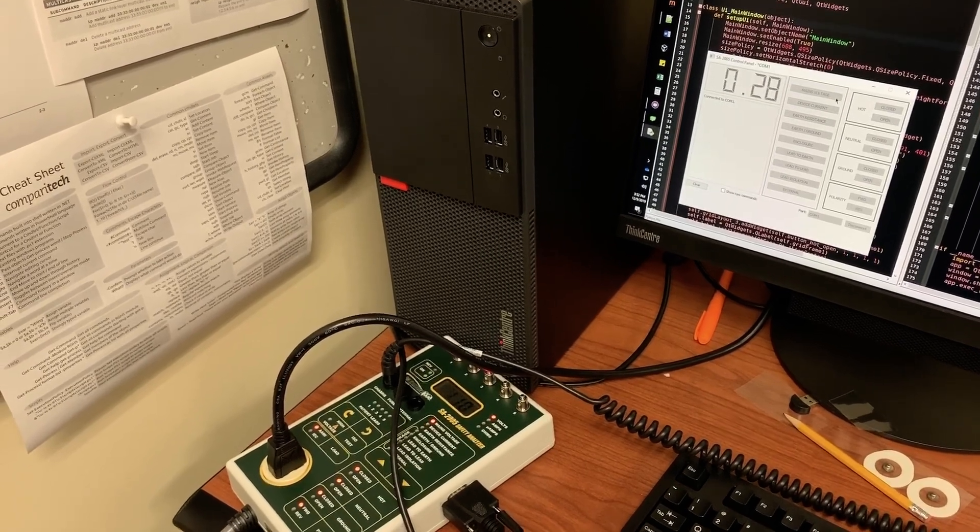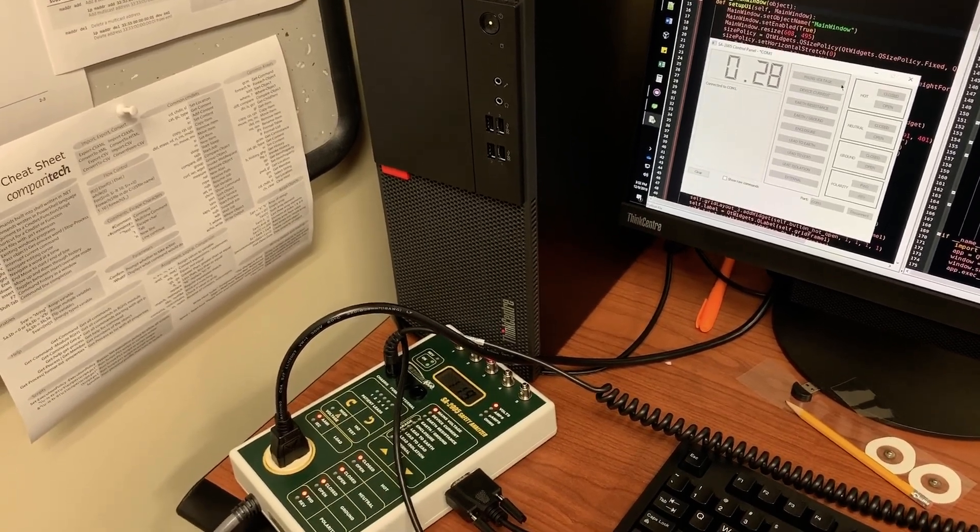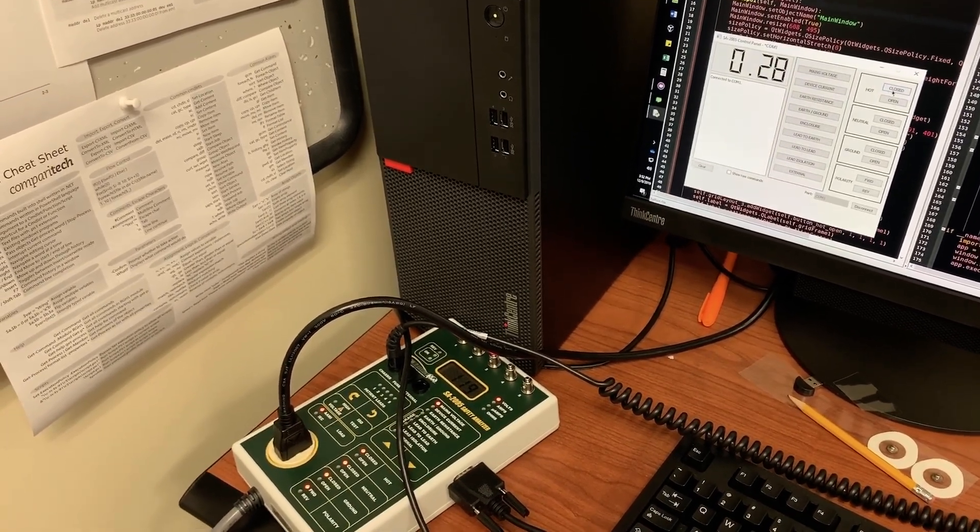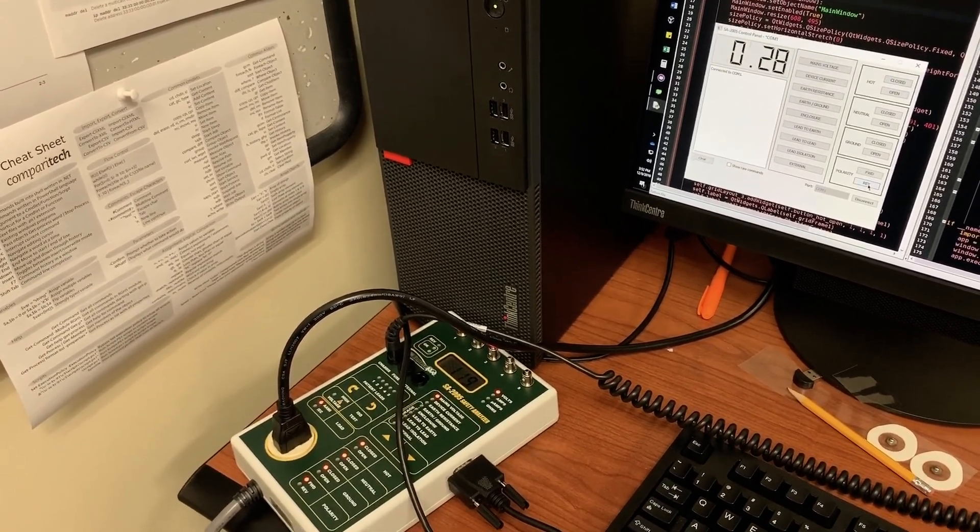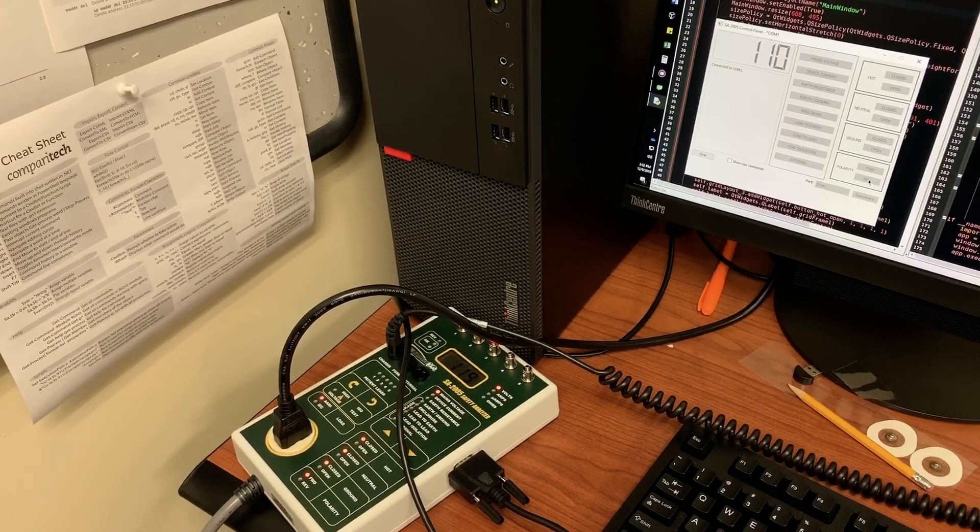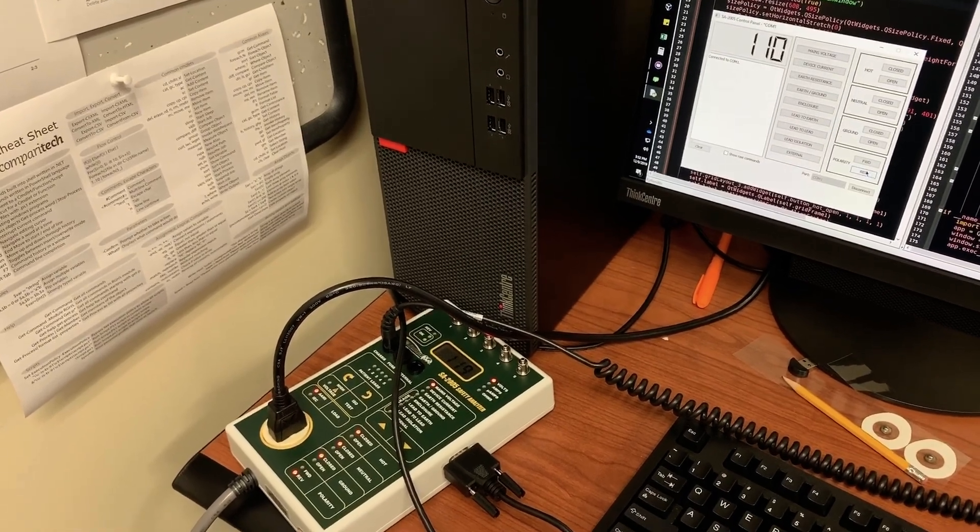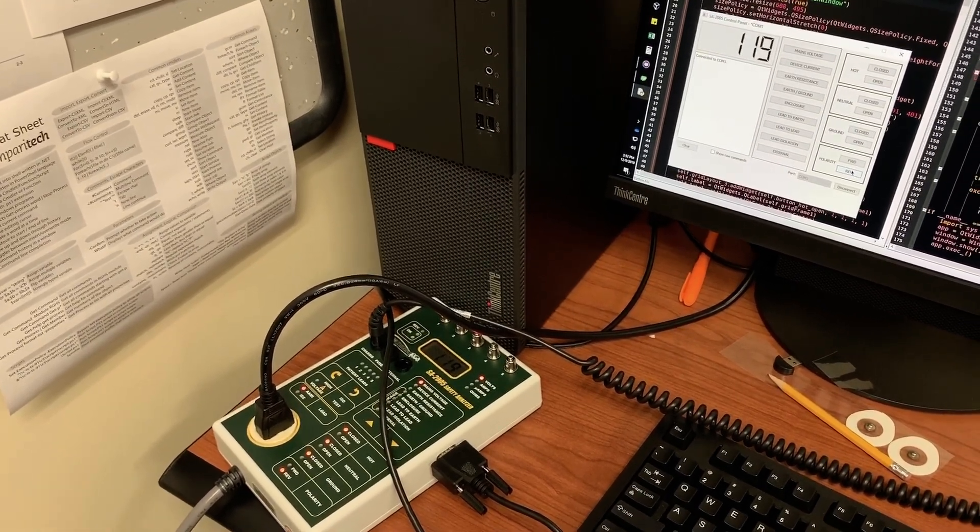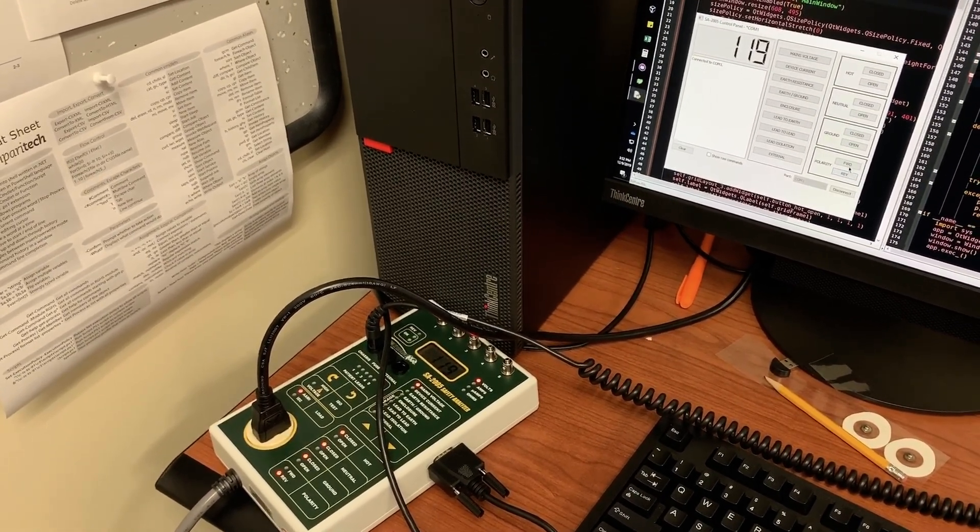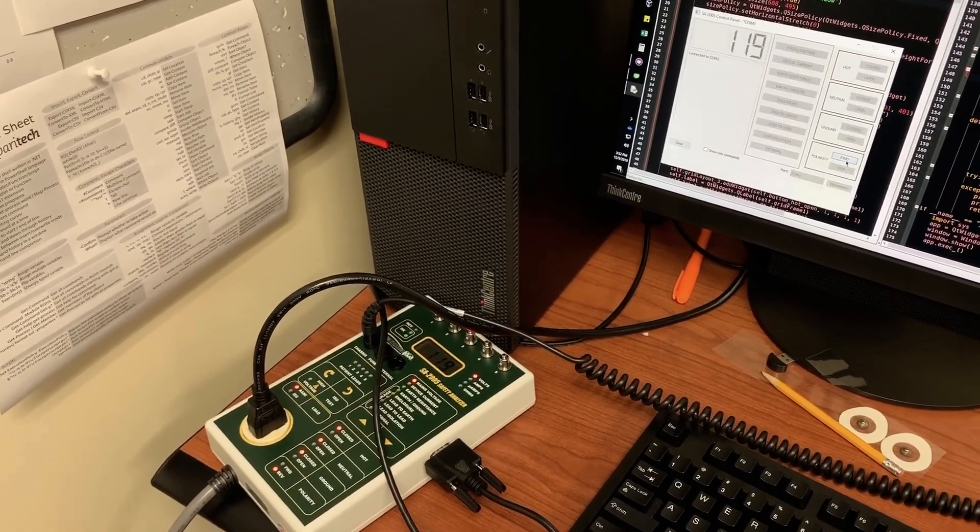So for now it does have basic functionality. Some of the commands don't work and there is currently not any options to do testing for the patient leads.